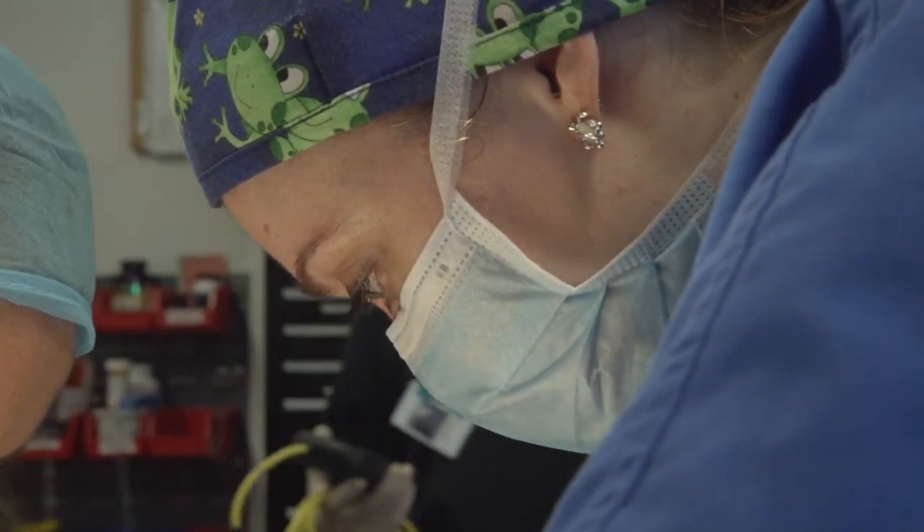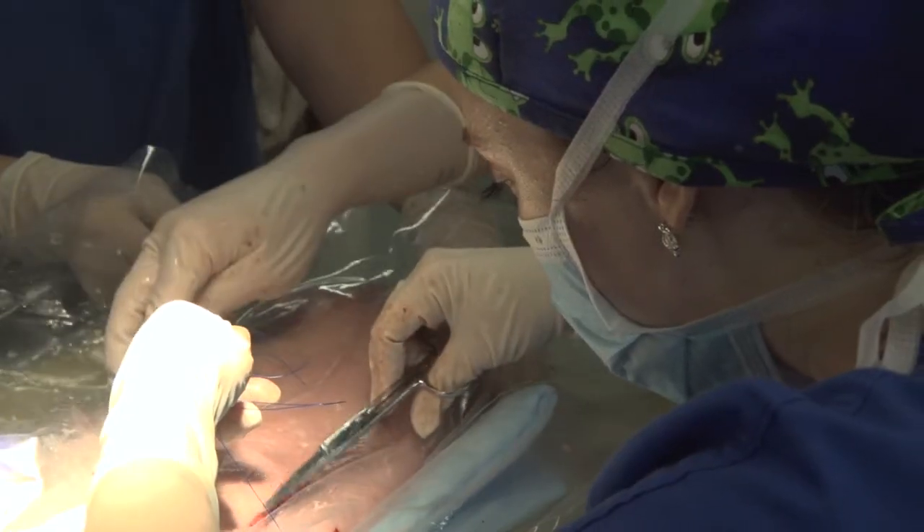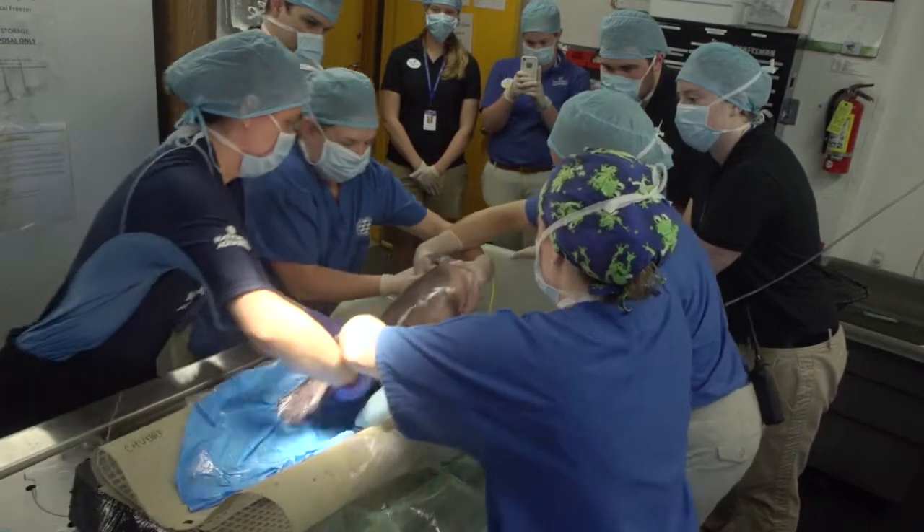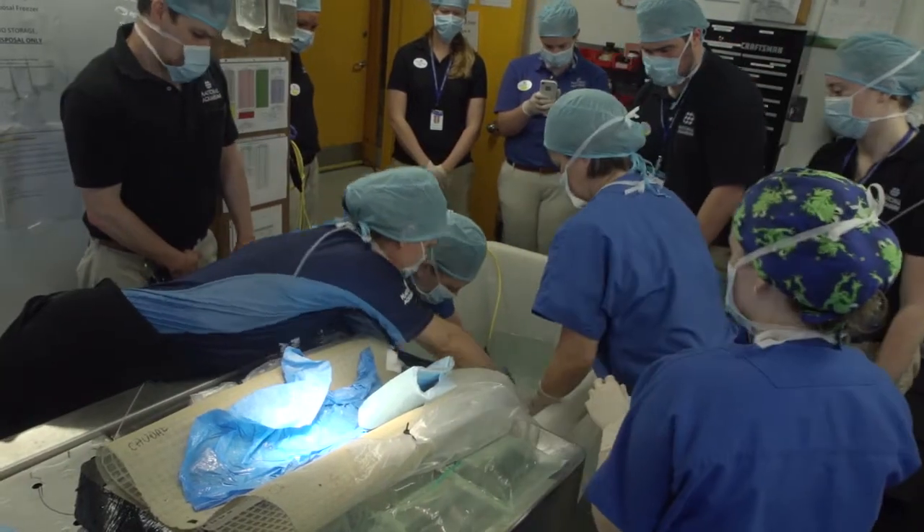Once we're done suturing, the animal is ready to go back into recovery water — water that doesn't have any anesthetic solution. Usually we like to see them recover in about five to ten minutes.